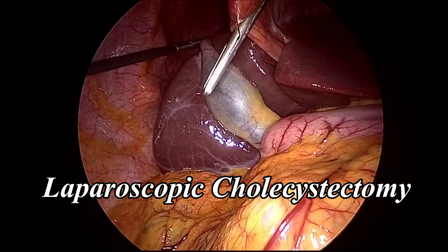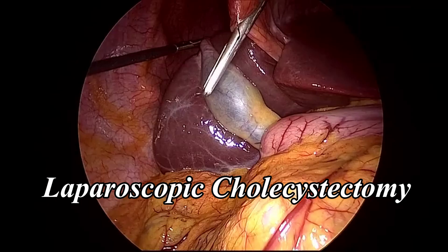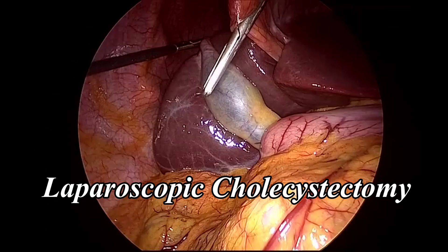Step 6: Closure and Postoperative Care. The camera is removed under direct vision and all port sites are inspected. Ports 10 mm or larger typically have their fascia closed with 0-absorbable suture. Skin is closed with 4-0 monocryl, glue, or staples depending on surgeon preference, and dressings are applied. Post-op care includes early ambulation, diet advancement as tolerated, and discharge within 24 hours for uncomplicated cases.